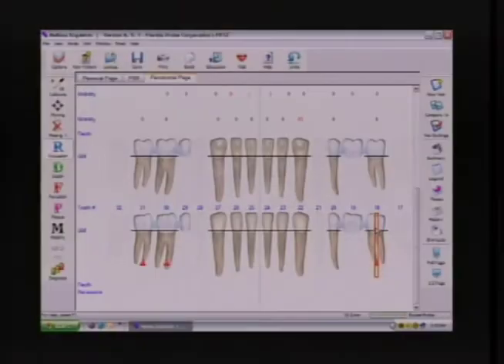It's going to take some practice, but when you're in the mouth, you don't want to keep looking down to your foot to see where it is, and it's all part of resting in the ergonomics of that foot pedal. Okay? We're at the lower arch on 18. Let's advance to 31. Midline. Does that help with the foot pedal? It does, yes. Okay.